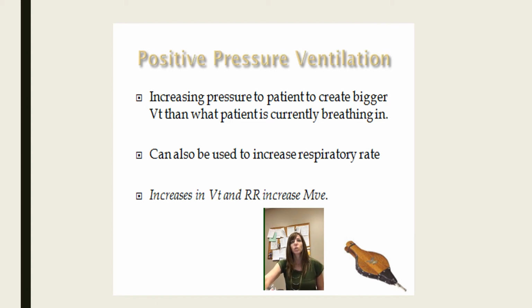So your job as a respiratory therapist is to find the best minute ventilation using tidal volume and respiratory rate so that the patient is comfortable and the CO2 is perfect. And we're going to teach you how to do that. So you can do that by either increasing the pressure or increasing the volume.